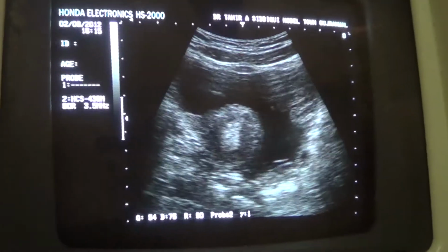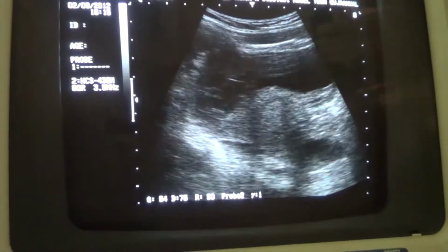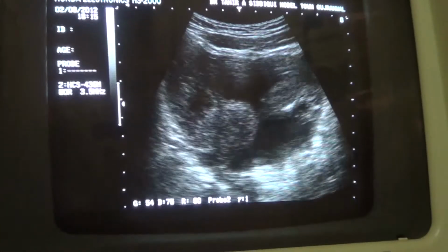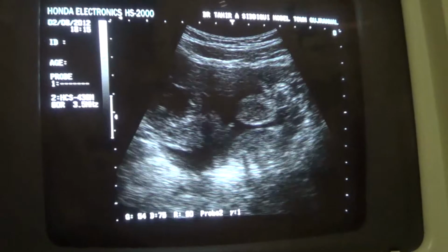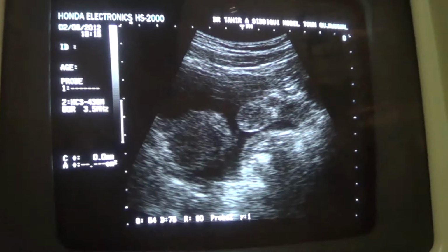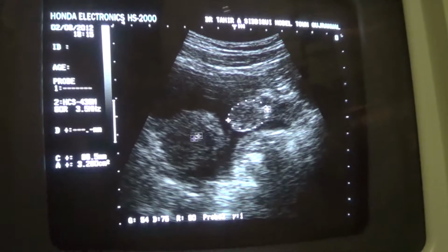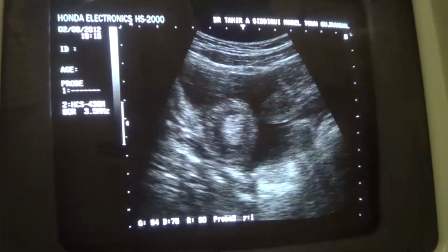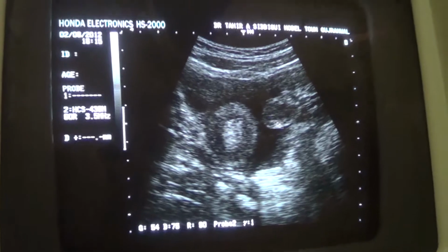Okay, now in transverse section, this is the transverse section of the uterus, and the uterus is seen surrounded by ascitic fluid. This is the left adnexa, and with this being the ovary, the left ovary is normal. There is some follicular activity seen. The age of the patient is 14 and she is in late secretory phase, as the endometrial canal suggests. This is the uterus in transverse section. This is the ovary.